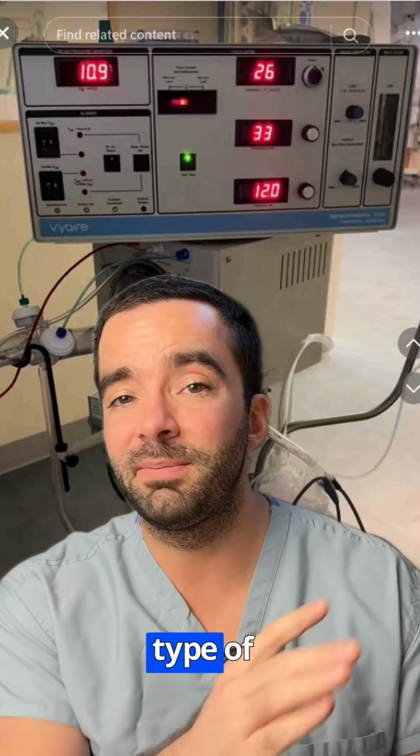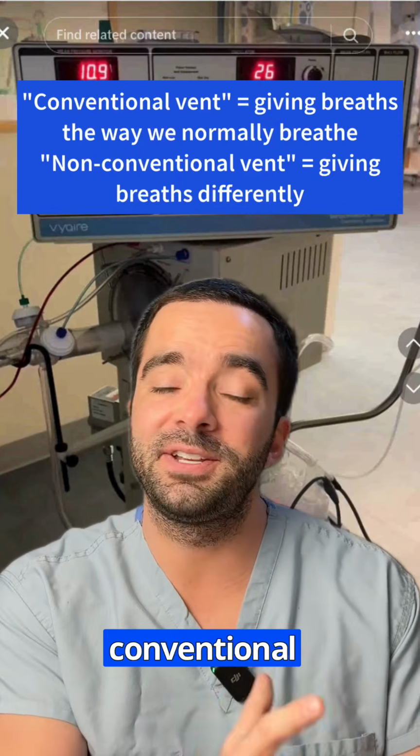When the lungs are very sick and those pressures are very high, we often think about switching to a different type of ventilator. And in this case, you call it a non-conventional ventilator.